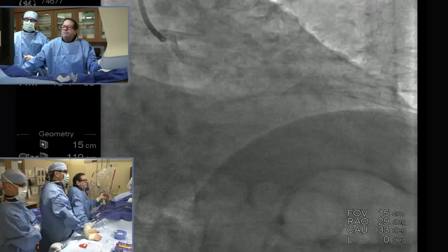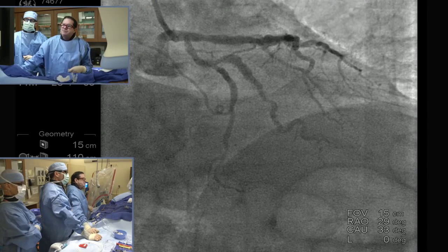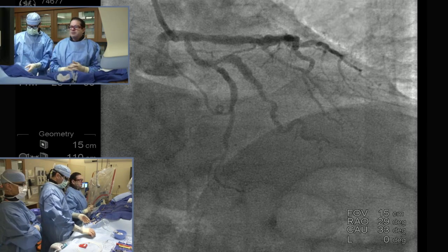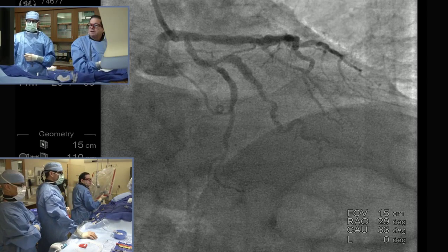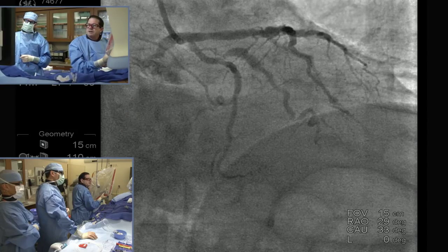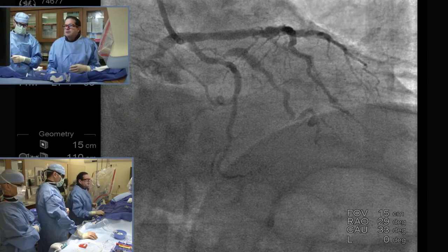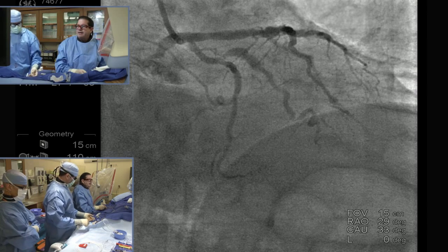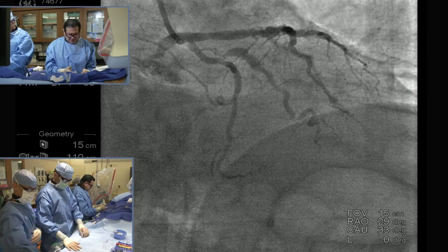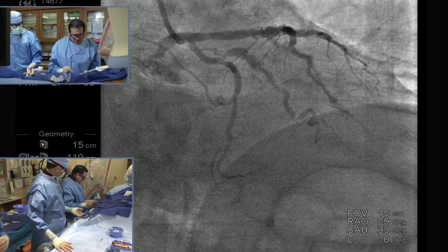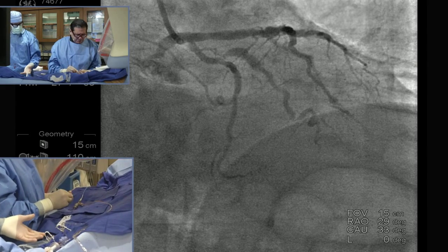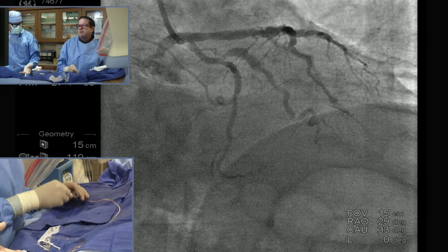Do you guys think that's a good rotoblator candidate, that OM? You think it needs to be treated? Yeah, I think it needs to be treated, and I think it's a good rota case, because the person before could not optimally dilate the lesions — undilatable lesions, so you have to do something different. I don't know if anybody would try a laser for that; I've found that the rotoblator is the way to go for these in my career. A cutting balloon first to see if it would dilate is another option, but I think a rotoblator makes a lot of sense here.